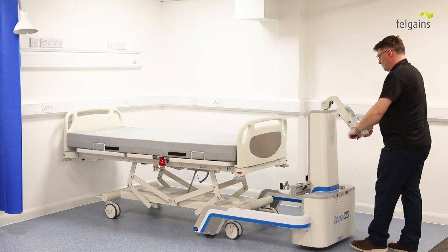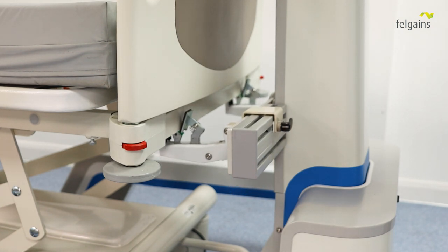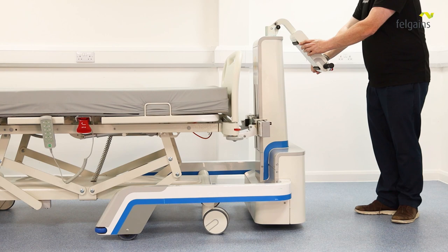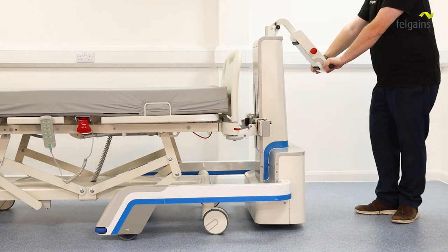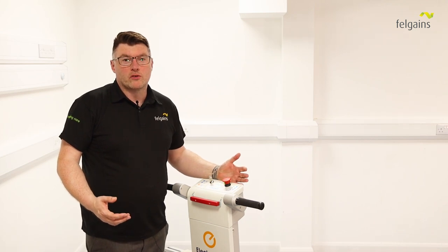Wheel the bed mover up to the bed or stretcher, then raise the hitch until it grips the bed frame. Please ensure you don't lift the bed off the floor when doing this. You are now ready to move your bed or stretcher.